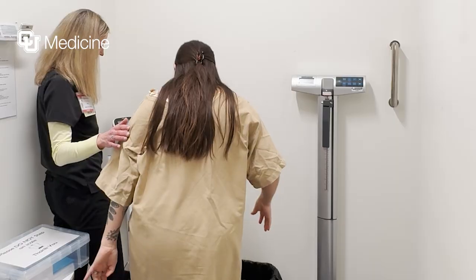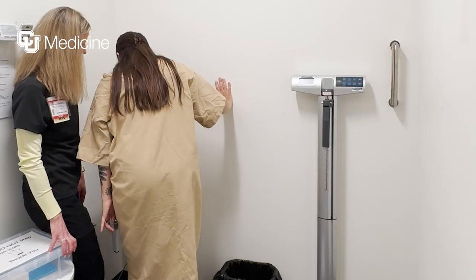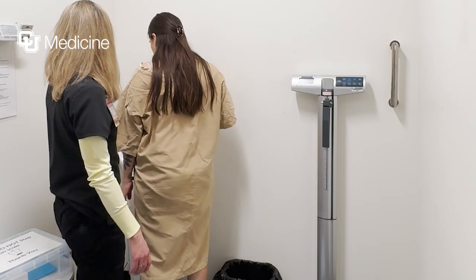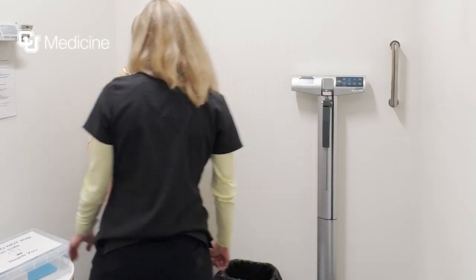We have you empty your bladder, and patients shouldn't be on their period because it can affect the results. Then we have you step on the machine — we make sure your feet and hands are clean, and then you follow the prompts on the InBody. It takes probably less than 30 seconds for it to read. You step off, print out your results, and we go over them.